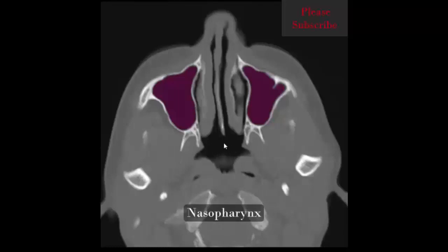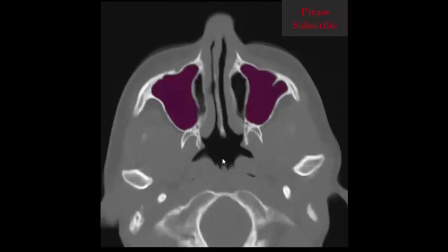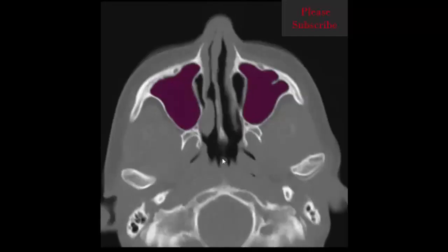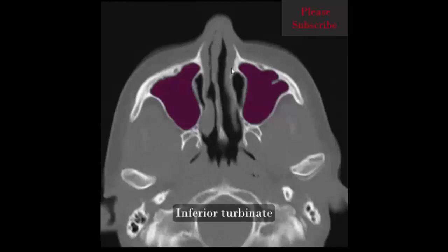Here we can see the nasopharynx and pterygoid plate. Also visible are the right and left maxillary sinus, nasal septum, nasal cavity, and right and left inferior turbinate.